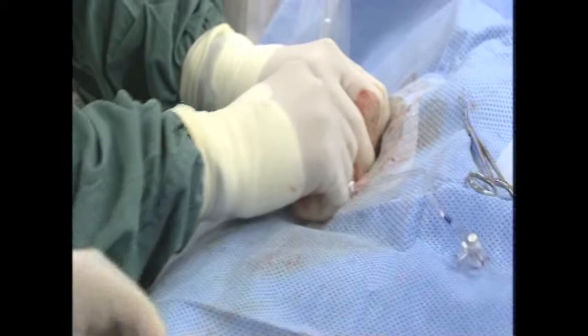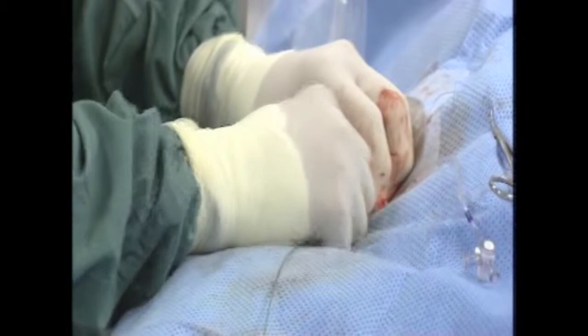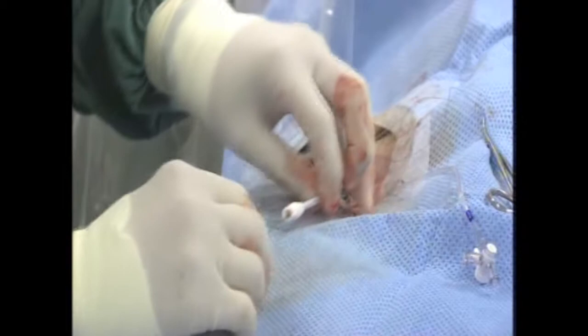This is still the ACP device. Because of the way the stabilizing wire is arranged, this device needs to be back-loaded. We selected the 30mm device — the largest available. I think it's going to be barely enough. This is a challenging case, and the appendage is quite large anatomy.